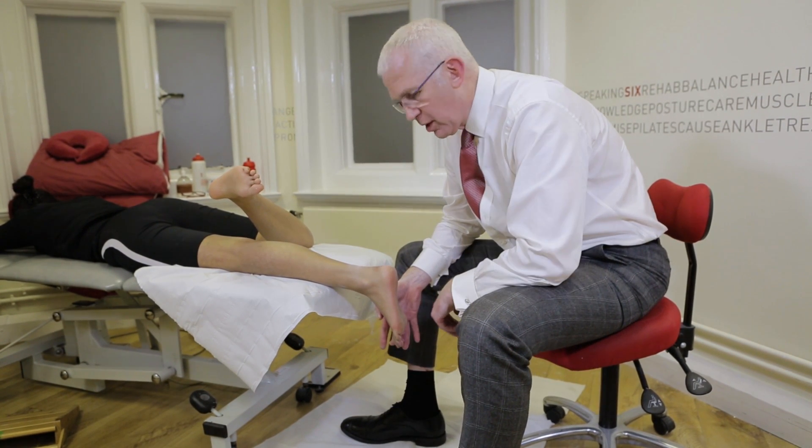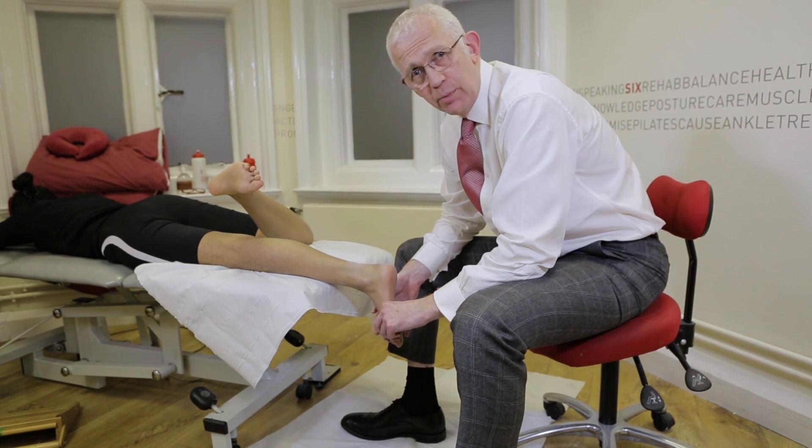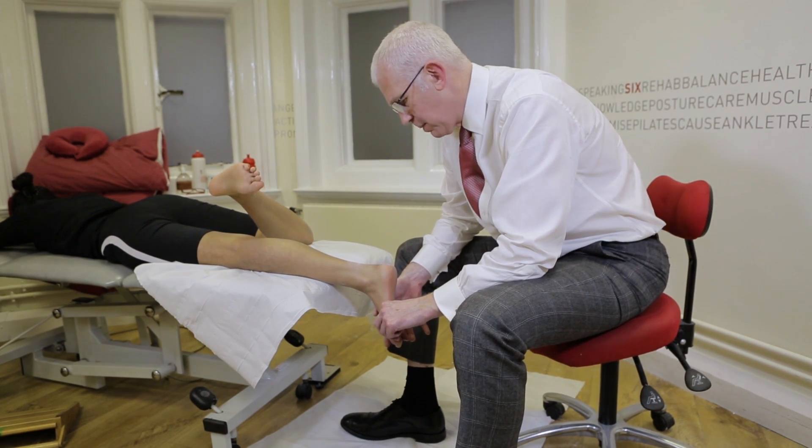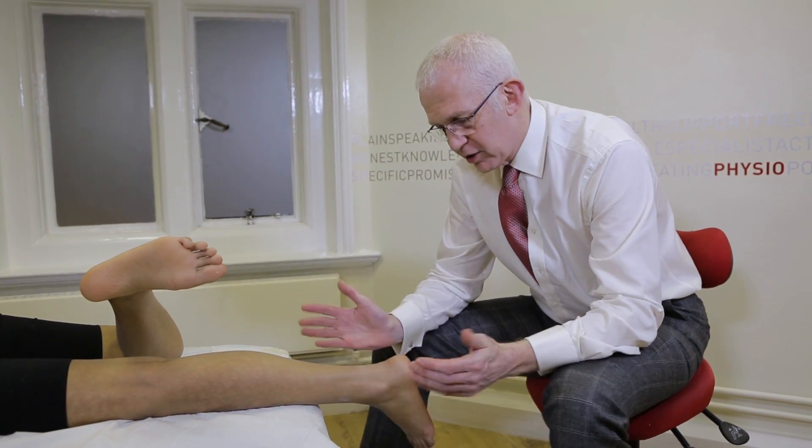In some instances, if you have someone with a very rigid flat foot, you may even consider taking a pronated cast. But that's much less common. The next stage is preparing the plaster of Paris material.